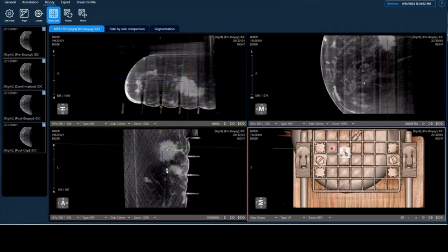We can drag this mask on top of this grid hole. And if the dot is not perfectly matching in the needle block, we can rotate it so that there has to be a needle hole that matches the entry point to guide the needle to set up the cannula. Once everything's done, the doctor has all the information necessary to insert the biopsy cannula. So we have the grid location, and we have the depth. Following the biopsy device instruction, they can insert the biopsy cannula.